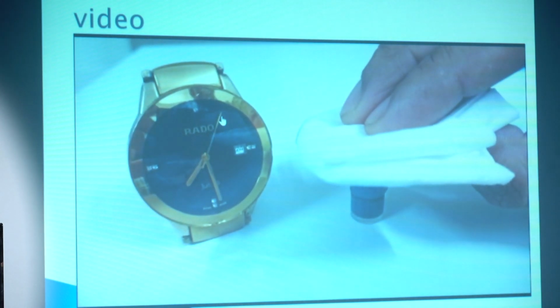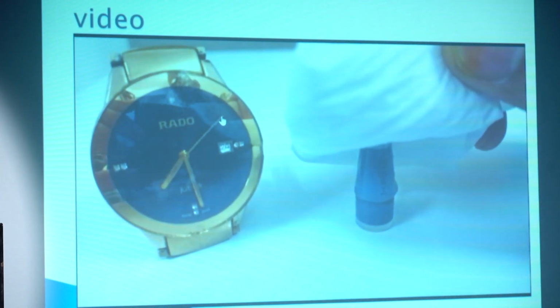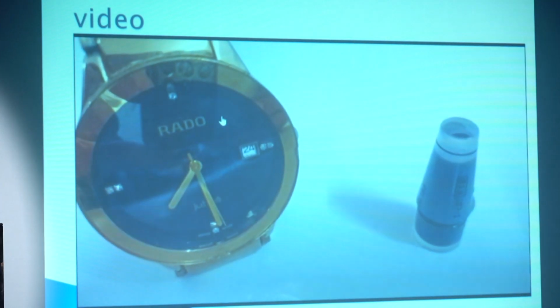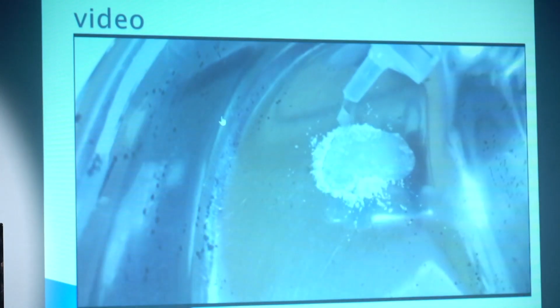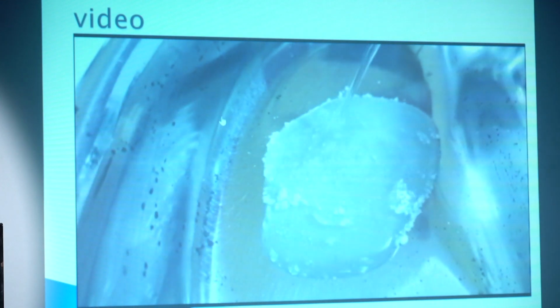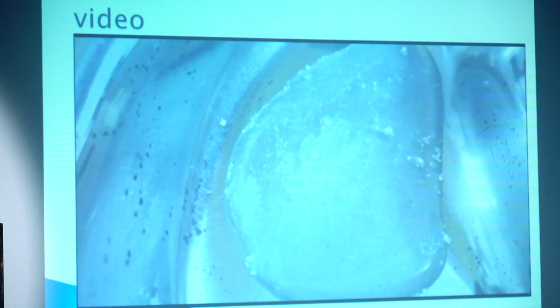The 10 seconds or 15 seconds is enough for the sterilization, and leave it to dry, and after that, whenever you want to use it, you can use it. Same thing you use for the bleaching, at 1:10 dilution, and touch this mixture to the prism and dry it and wash it.